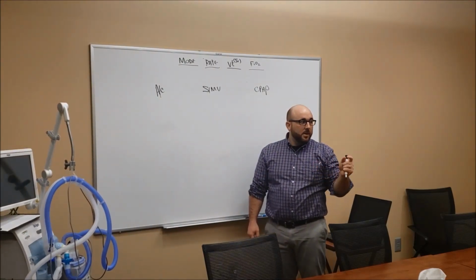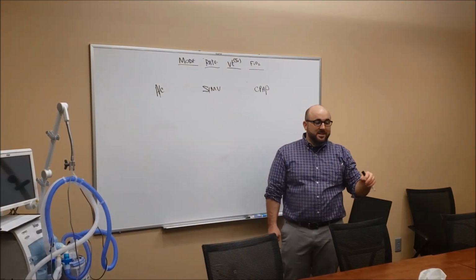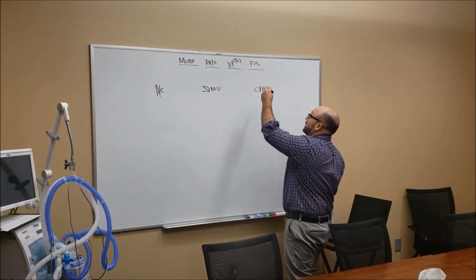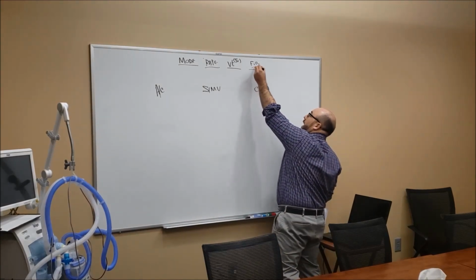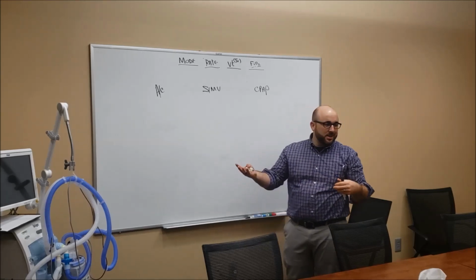Is that the peak flow? No, that you're thinking of TI. That's inspiratory time. That's good though. I'm glad I'm talking about this. So FiO2 is fraction of inspired oxygen. In other words, it's the oxygen percentage you're delivering.